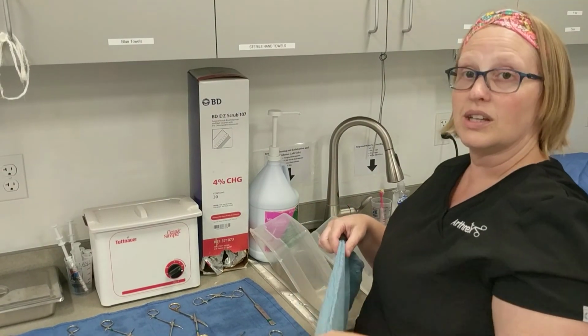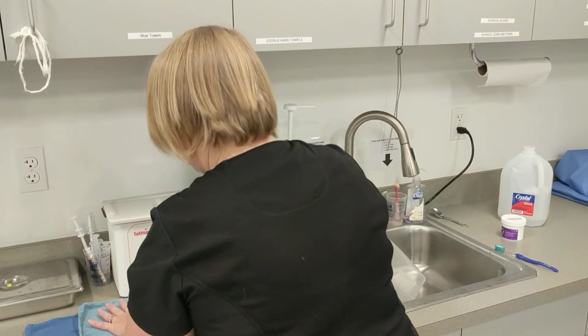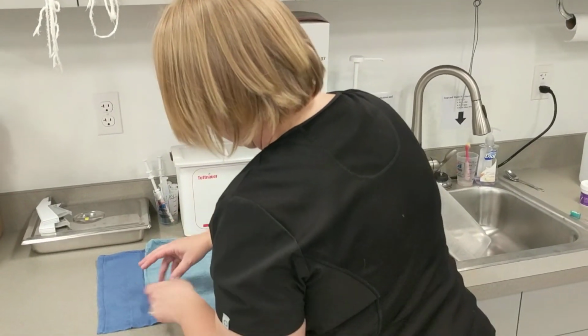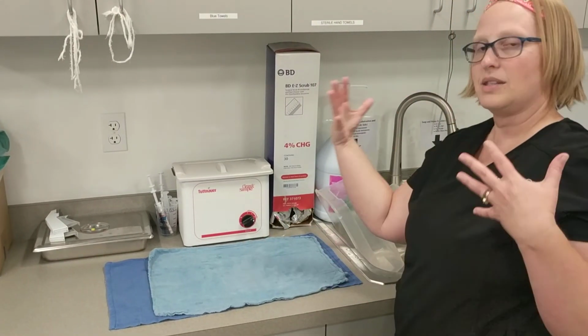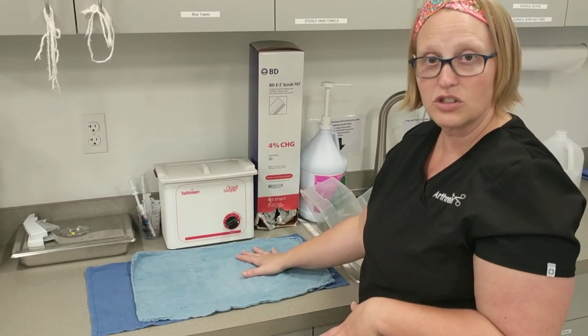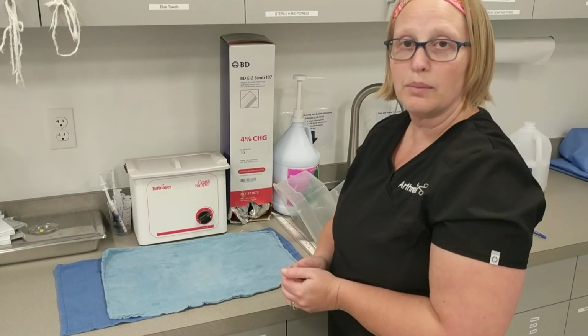What I'm going to do currently, because I am waiting for the other half of this pack, is simply cover my instruments with this dry towel because I don't want excess debris or anything to fall onto my clean instruments. Leave them covered until I'm ready with the next half, and then I can hand dry and prepare them for the pack.